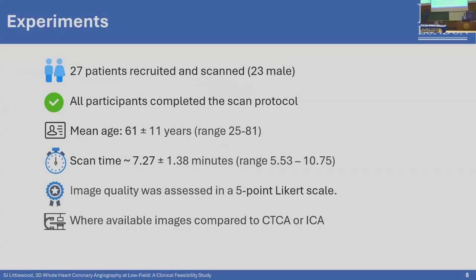So we recruited and successfully scanned 27 patients with a range of different cardiovascular conditions, with all participants completing the scan protocol. The mean age was around 61 years, and the average scan time was around 7.25 minutes.